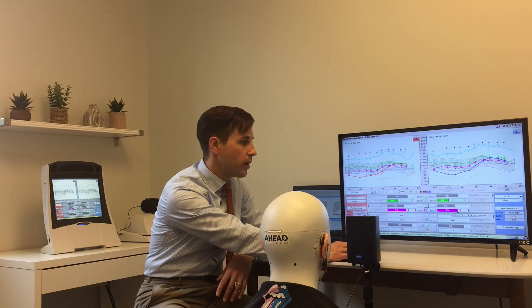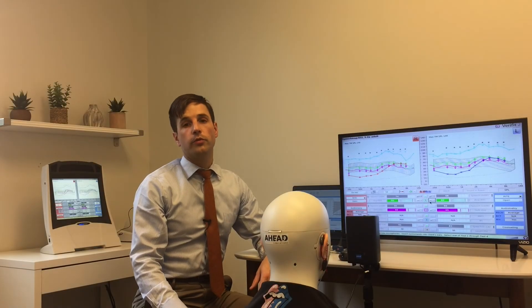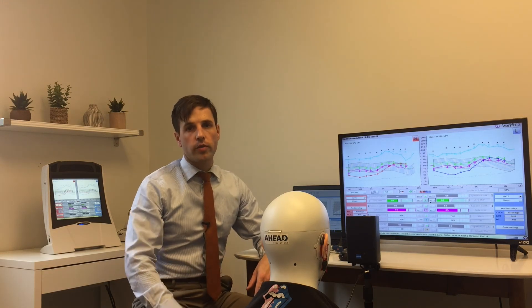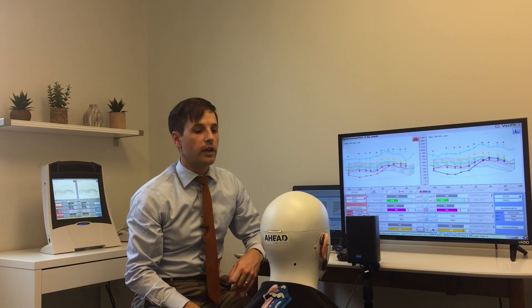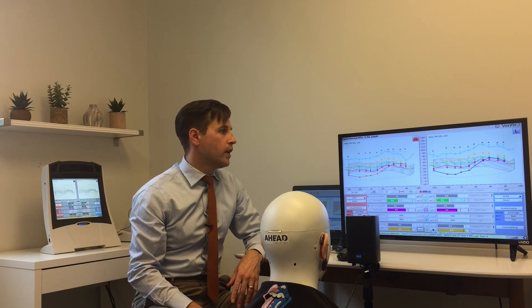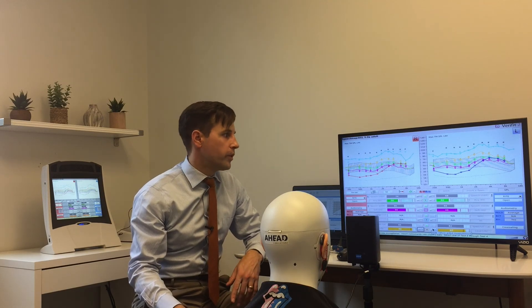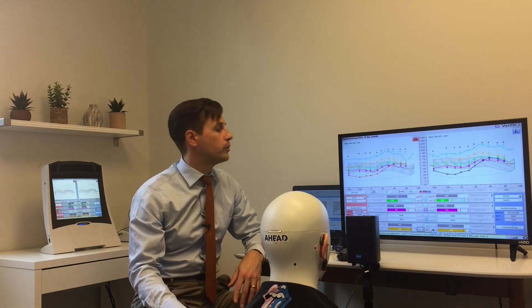The last thing you might want to do is run loud speech to get an idea of what that's looking like. Let's do a quick run for loud speech with Carl. He said it was loud but okay — not uncomfortably loud. We're pretty much right on targets there. Of course we could scale that down a little bit, but the only thing with that is we want to make sure we're keeping an eye on the compression ratio — we don't want to bring it down too much.